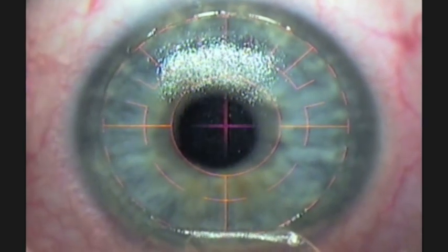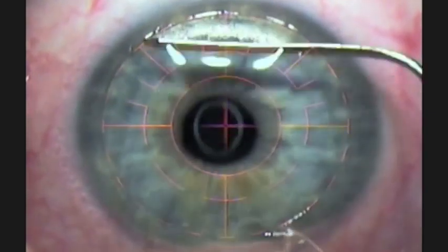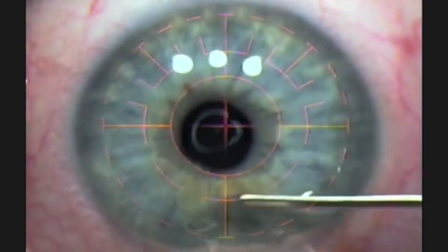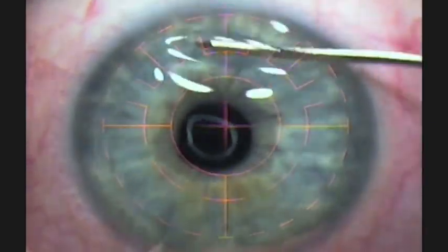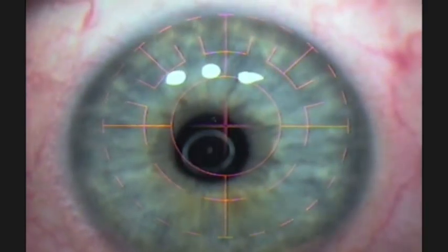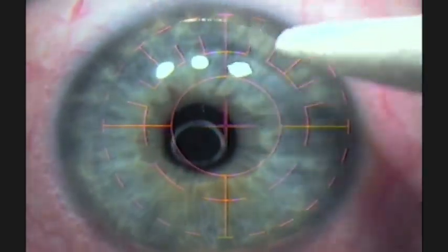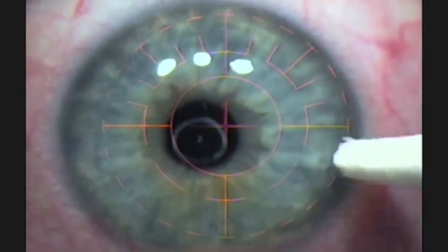Once the procedure is done, we irrigate underneath the flap, which is replaced back in place just like a natural bandage. It fits right back like a jigsaw puzzle. And all we do is dry the edges and we're done.